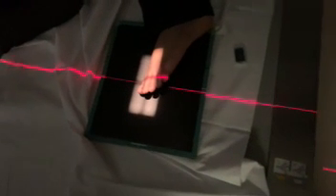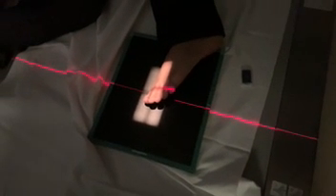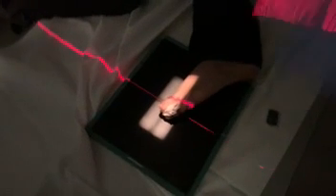Okay, so in that situation, you will need something to move the toes out of the way. So you could use tape. Okay, if you don't have tape, you could use something like paper towel, gauze, something that's somewhat radiolucent, right, to help kind of pop that toe out of the way of the other ones, right? Something like this, okay? But either way, your goal is to try and get whichever toe you're interested in, right?